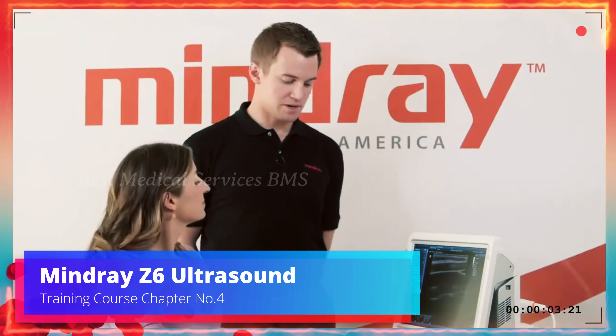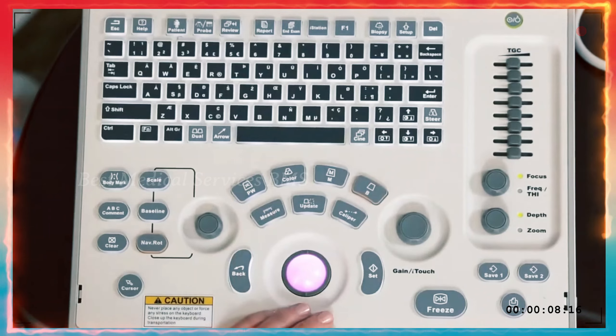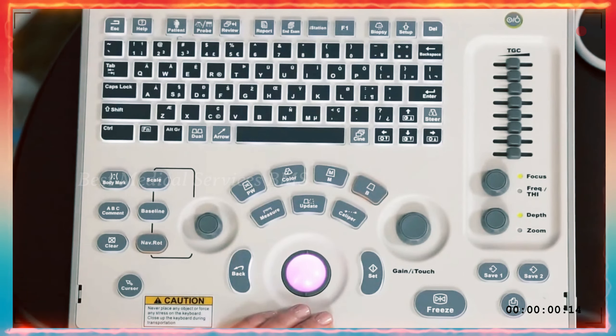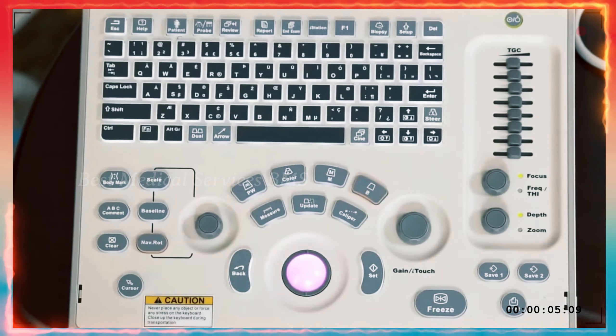Now that you're scanning, we're going to talk about the modes. You can see that B mode is illuminated in orange — that's just general basic 2D scanning. Right next to it is M mode, color, and pulse wave Doppler, so you have all your modes in a row. Let's start with M mode first.